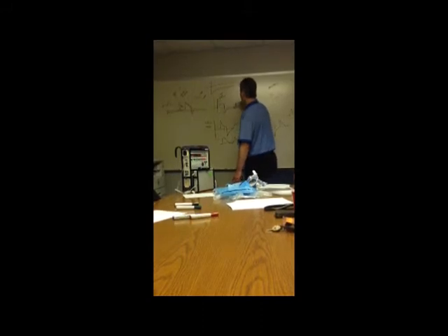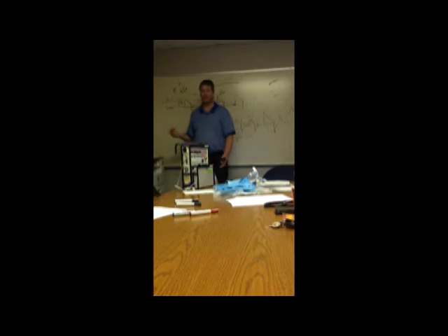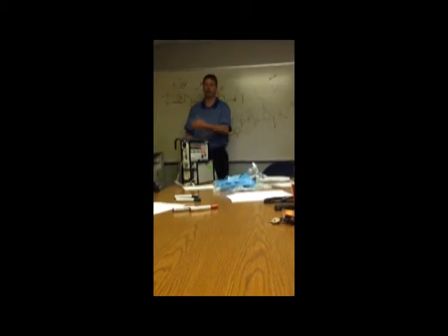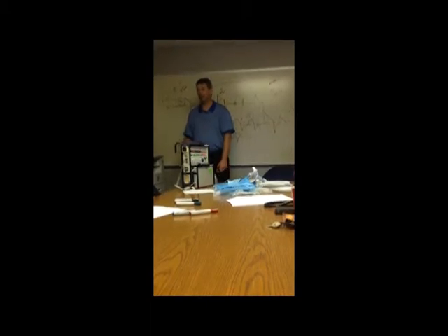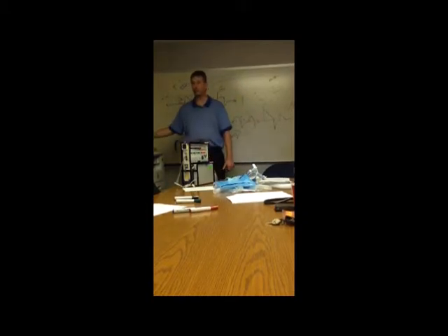But the IPAP is what it is trying to deliver when it gives a breath on BiPAP. So if I've got the IPAP down to 10 or 12, that's not a lot more help than just breathing through the system. So chances are, if you take them off, the next step down from 12 or 10 is off. Yeah. So if you bring somebody on 12 or 10 or even up to 15, there's a good chance we'll turn them off because that's the next logical step down in weaning.